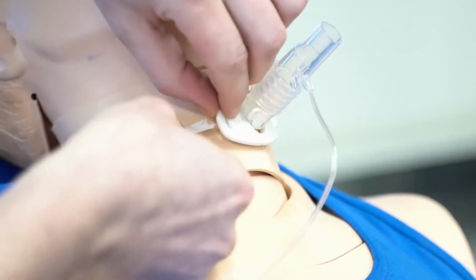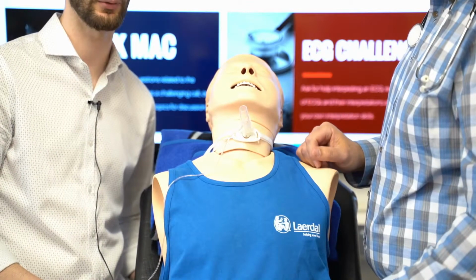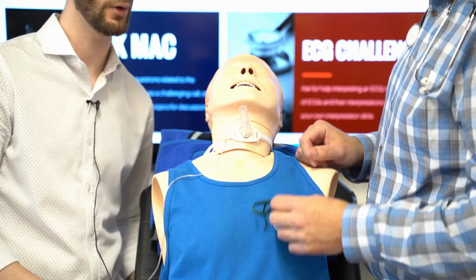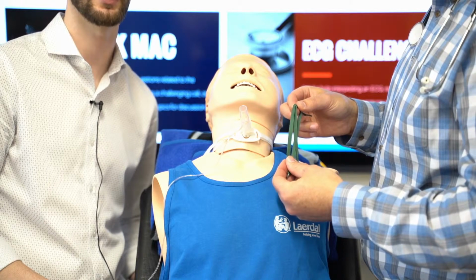You can see Pete here is using twill ties that are provided with the brand new tube. Now, if those aren't in place, we're going to need to get creative. That may mean using tape or even the elastic band from an oxygen mask.